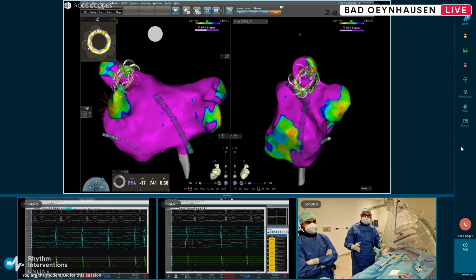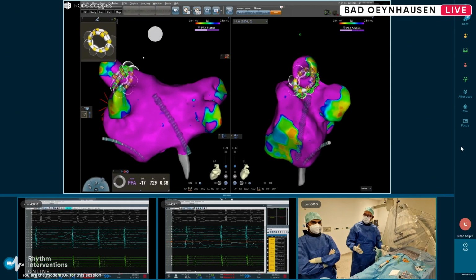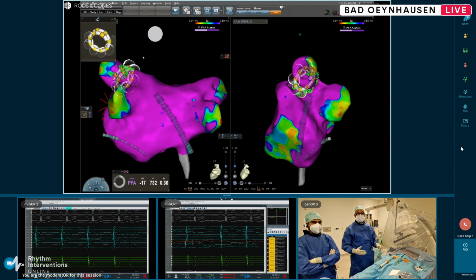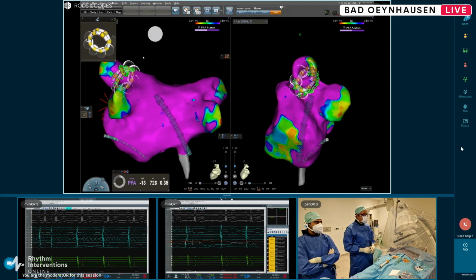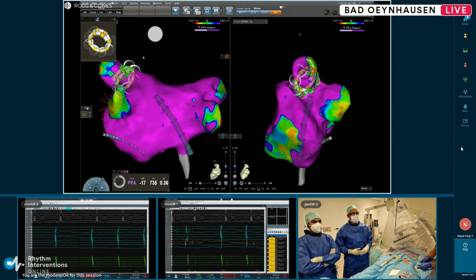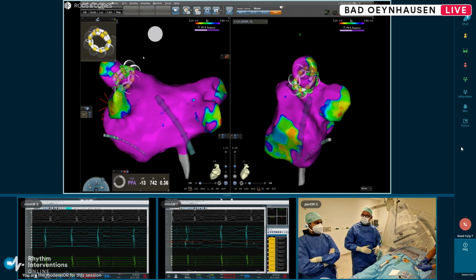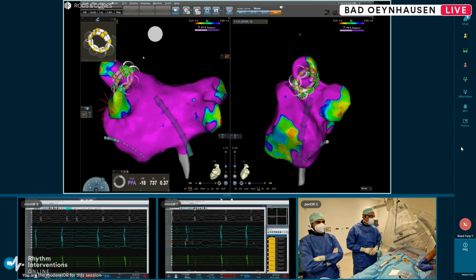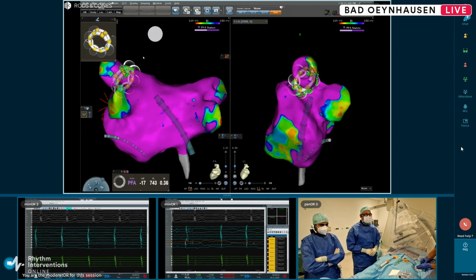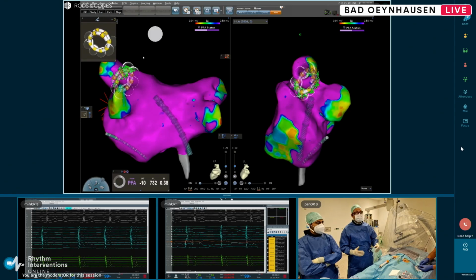So this is more or less our approach. It's also important to mention, when you look at the patient here, there is no anesthesiologist around. We have a nurse-administered protocol. Tatiana is running around here, and she is taking care more or less of the analgesia of the patient. And I think it's also interesting for you to see in a couple of minutes that when we give these applications, the patient is normally not moving a lot, not coughing a lot.